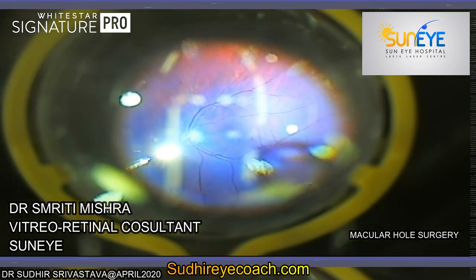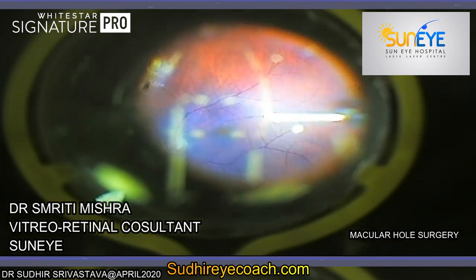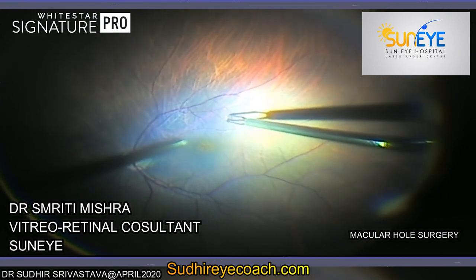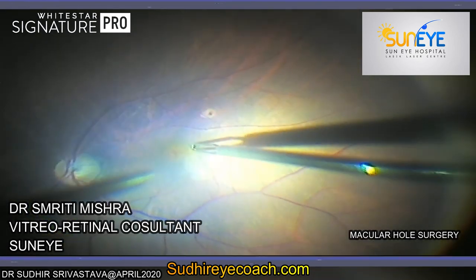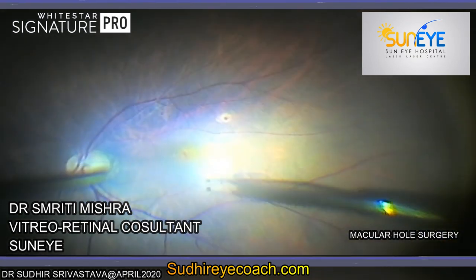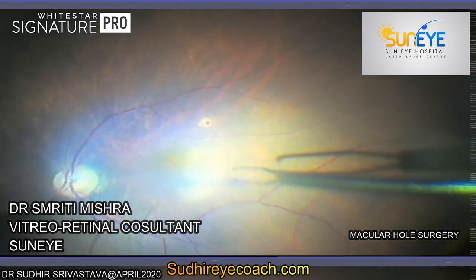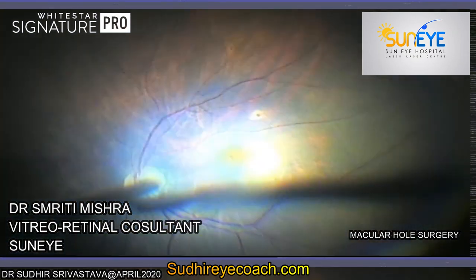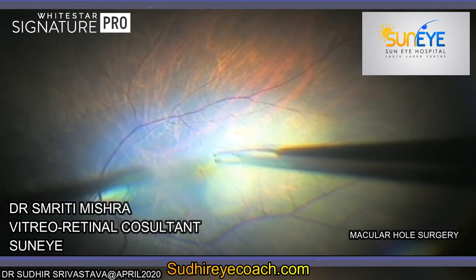The second rexis is done on the retina, where we peel the internal limiting membrane (ILM). Before starting peeling of ILM, total posterior vitreous detachment induction is a must. Then on the exposed surface of the retina or ILM, we instill the dye either in the presence of air or in fluid. For staining the epiretinal membrane and ILM, we use trypan blue 0.15% or Brilliant Blue G (BBG) in combination with polyethylene glycol (PEG). BBG has more affinity with ILM.